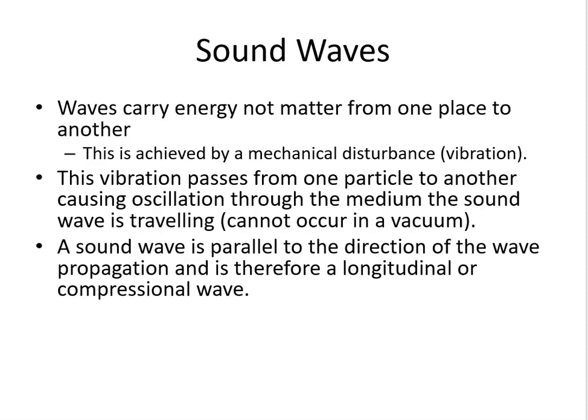So first we've got to learn a little bit about sound waves, and sound waves carry energy. They don't carry any matter or anything like that, they're just purely carrying energy from one place to another, and this is via mechanical disturbance or vibrations. So sound waves are effectively the passing of energy from one particle or one molecule to another, and this allows the energy to travel in pulses through that particular tissue or material, and different materials have a different speed of sound, which will become really important later on.